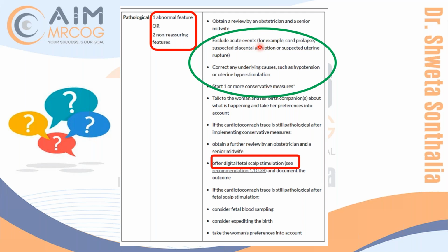Yes, infection in the mother. You might have seen in HIV, in HSV, we don't want to transmit the maternal infection to the fetus. So risk of infection transmission to the fetus is a contraindication. Acute event, as you told, is a contraindication. Birth should be expedited. Acute event needing expedited birth, then no point in doing the sampling.